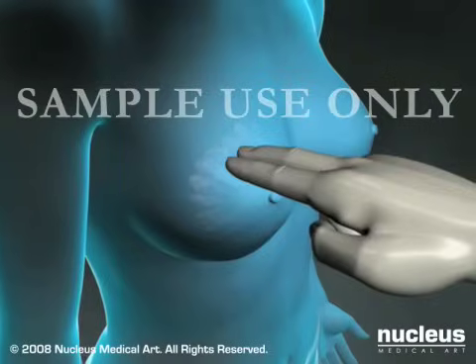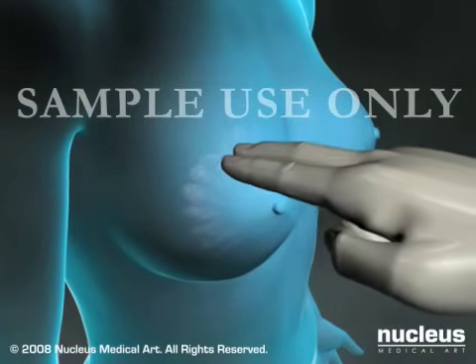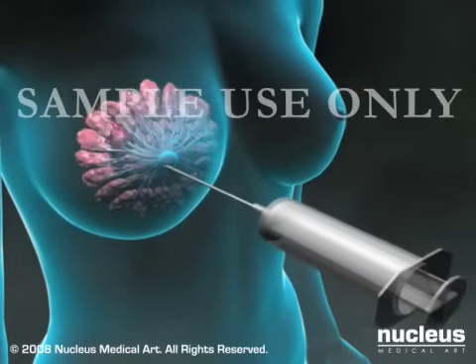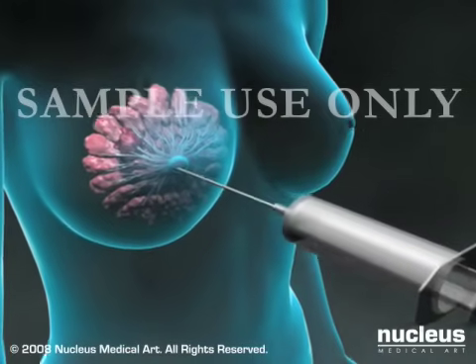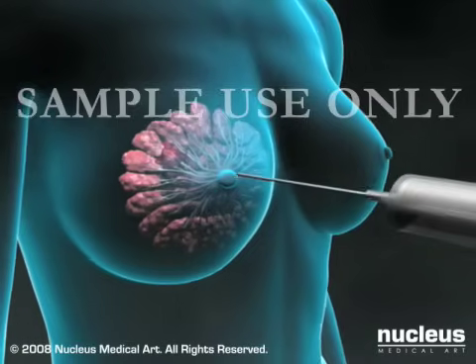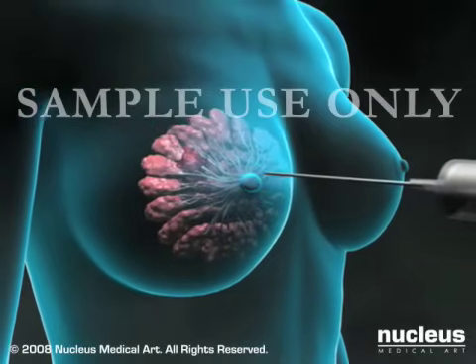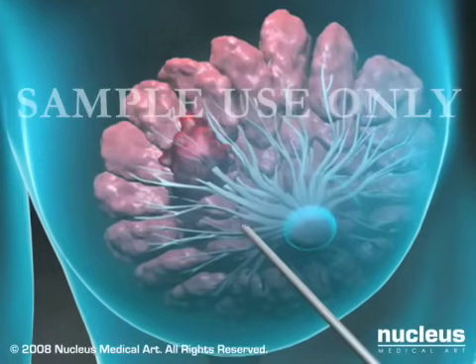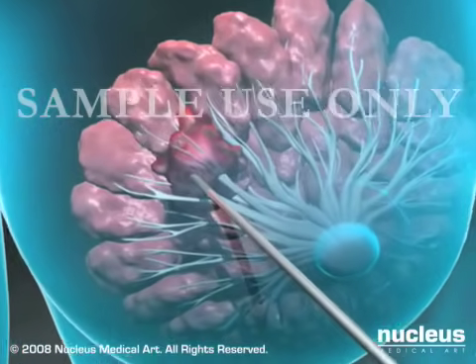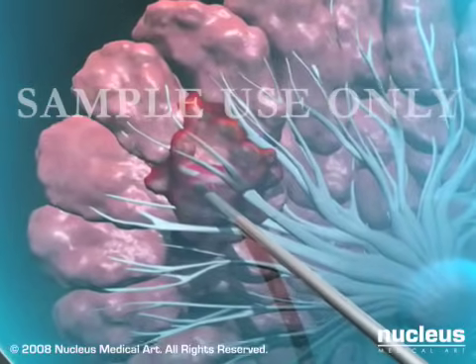If your physician can feel your lump, he or she will often perform a needle biopsy, which may take the form of a cyst aspiration, fine needle aspiration biopsy, or core biopsy. In each procedure, a needle will be inserted into your breast to remove fluid or to sample the tissue.